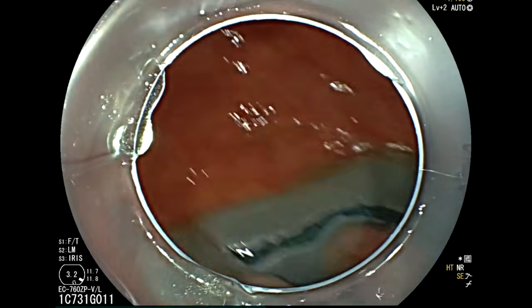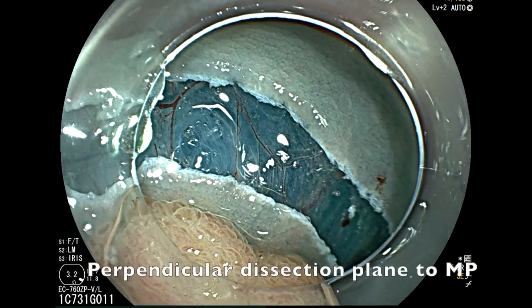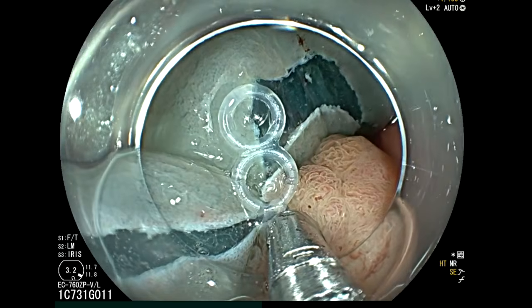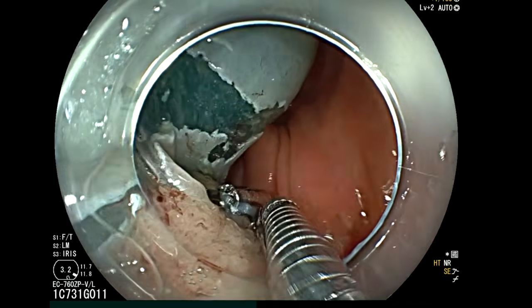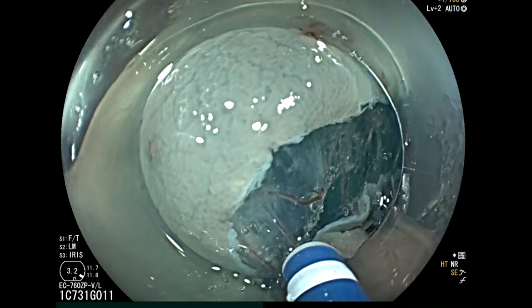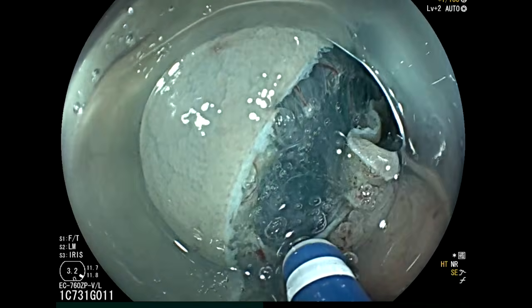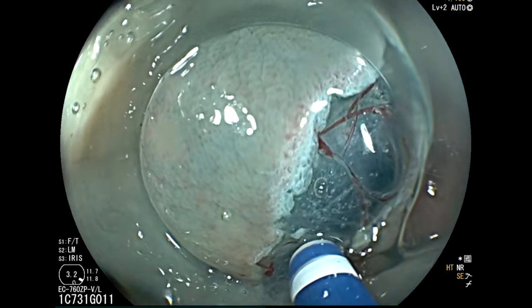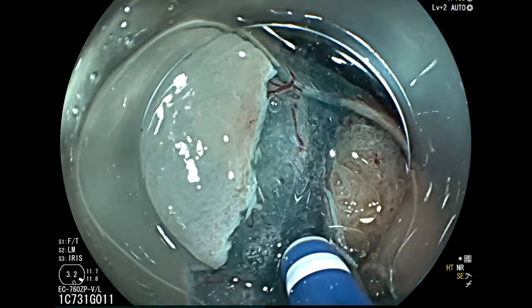Access to submucosa was not favorable with perpendicular view to the muscularis propria, increasing risk of deep mural injury. We then proceeded to multi-point traction strategy, placing the rubber band on the anal side of the lesion and the clips on the contralateral side, pushing them to the oral side so that we expose the submucosa. Same strategy applied by releasing the highest tension point at the level of the traction to allow us to access the submucosa safely.